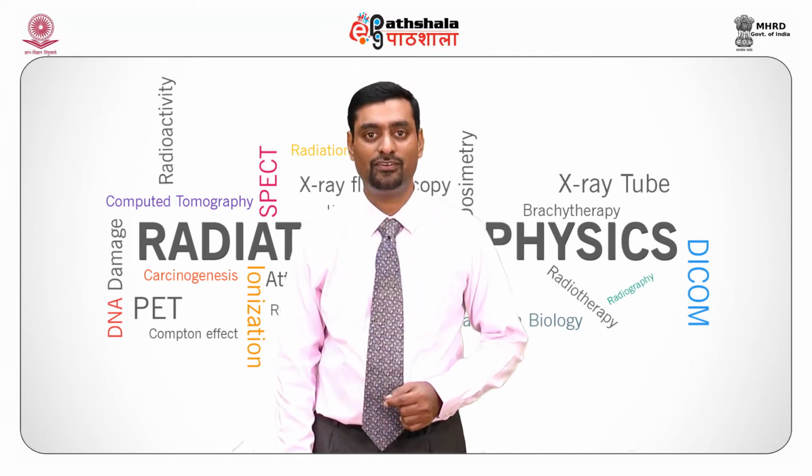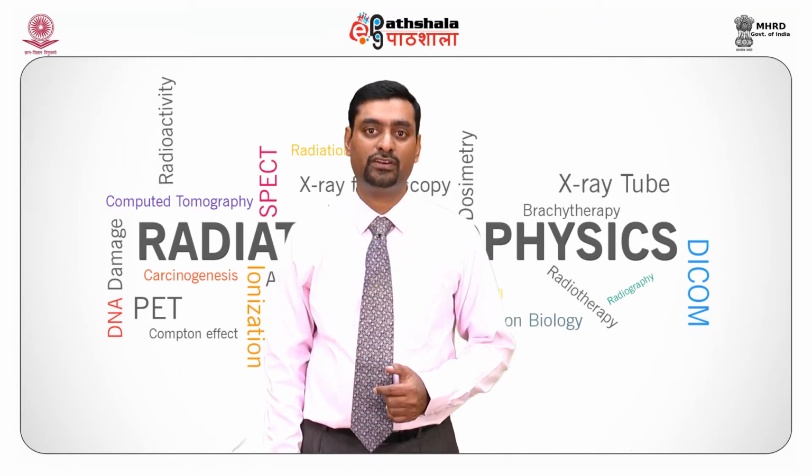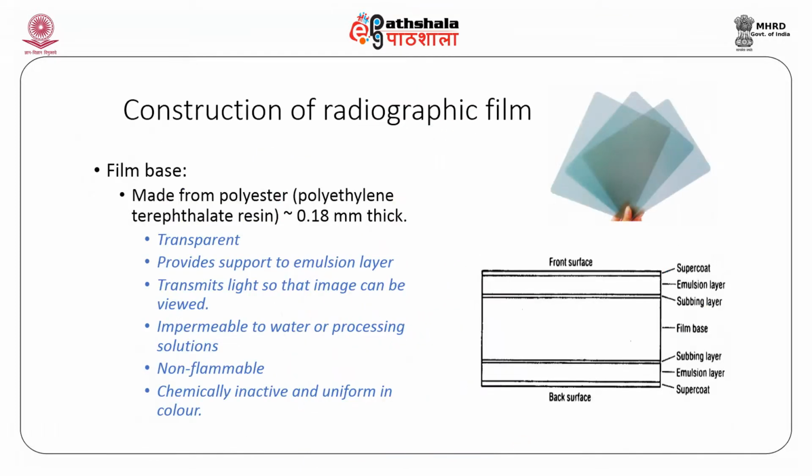Let us get into detail about the construction of a radiographic film. Let us see the film base. The film base is made out of polyester, which is approximately 0.18 millimeter thickness. What should we consider in a film base? Film base should be transparent, provide support to the emulsion layer, transmit light so that the image can be viewed, be impermeable to water or processing solution, non-flammable, chemically inactive, and uniform in color.